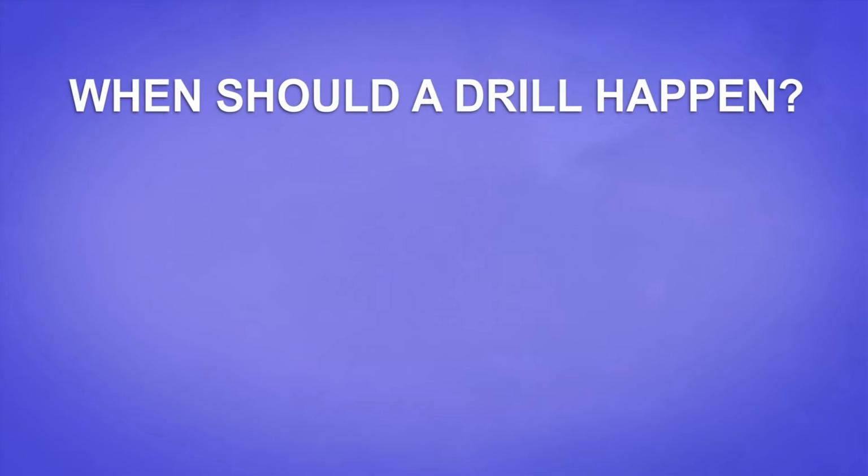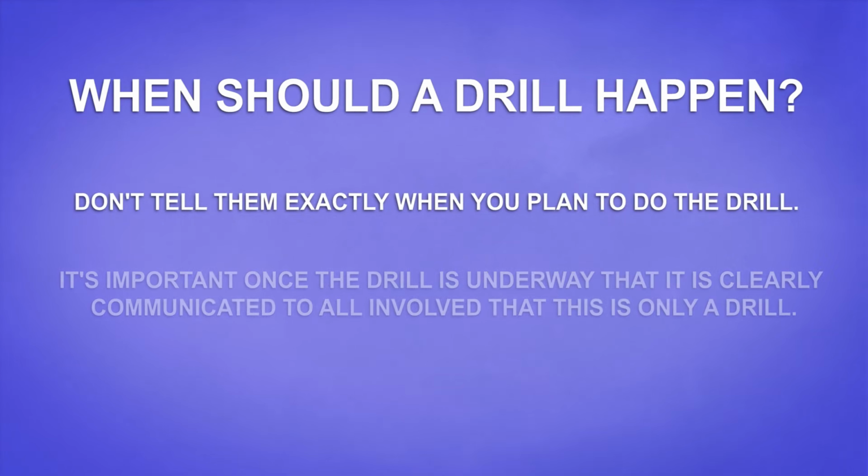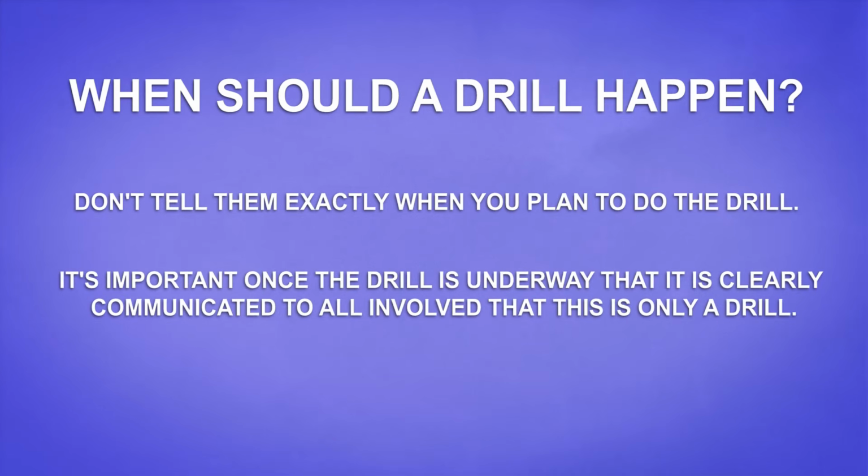When should a drill happen? Inform your team that you will be doing a cardiac emergency response drill in the next few weeks so they have time to review their cardiac emergency response plan in advance. Do not tell them exactly when you will do the drill. It is important once the drill is underway that it is clearly communicated to all involved that this is only a drill.